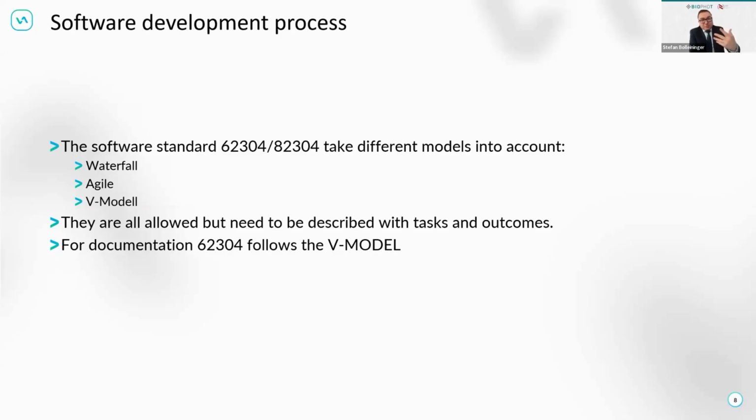On the way towards it, so creating the first requirements, creating the first information, looking into the architecture, and letting the product grow over time, in that moment the standard is very open. It does not limit you to only V model or waterfall or agile. It gives you all kinds of possible interactions. And that's the good thing that has been done in the past, and that's very good also in the first communications within the standards, to see how they interact with each other.